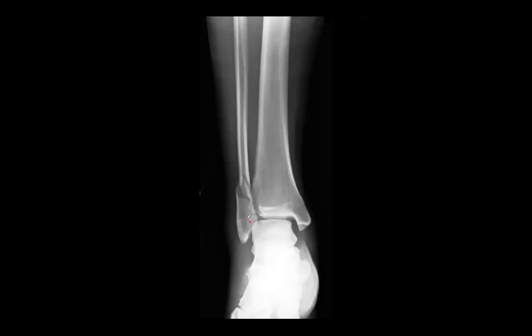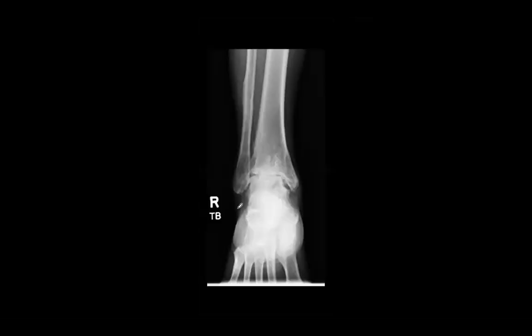Something else we look at is with the externally rotated fibula, you may see widening of the fibular fossa there. So you see more radiolucency distally. Sometimes we have patients who have had previous injuries or they have ankles that are healed in an abnormal position. How would we, or what's abnormal about the way that this person's fracture healed? Short fibula. Good.